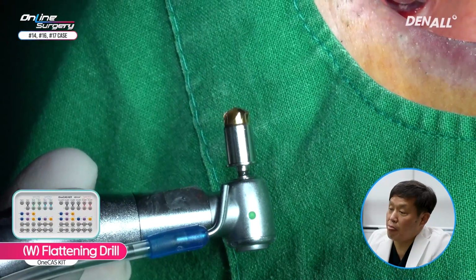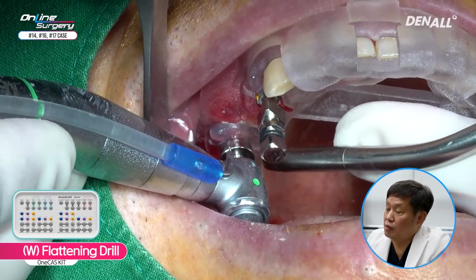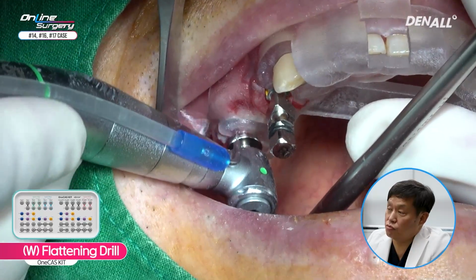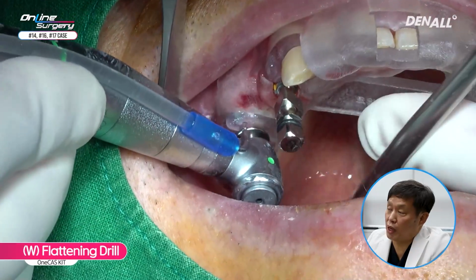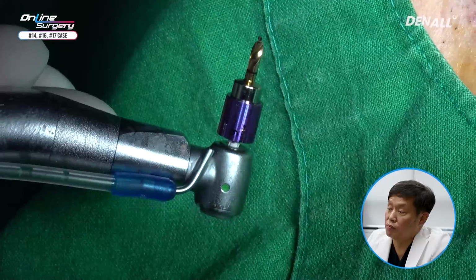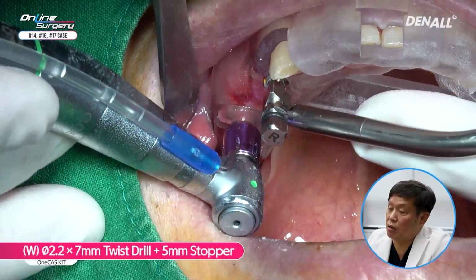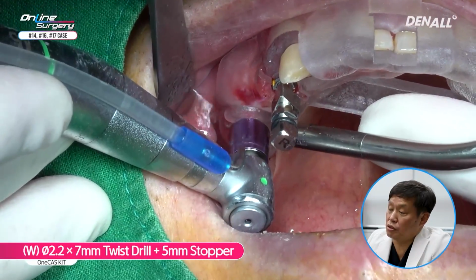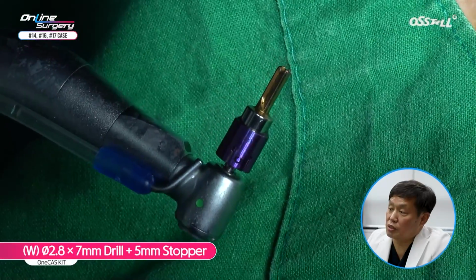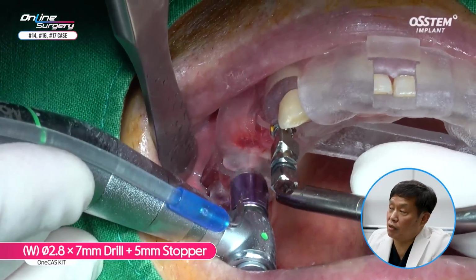Initial torque is about 30 Newton centimeters, and flattening drill is used in number 16. Flattening drill was done because the plan was to place it deeply. Because the residual alveolar bone height was assumed to be 3 millimeters, 2.2 by 7 millimeter twisted drill with 5 millimeter stopper was used first. With the use of OneCAS kit, 2 millimeter drilling can be done.